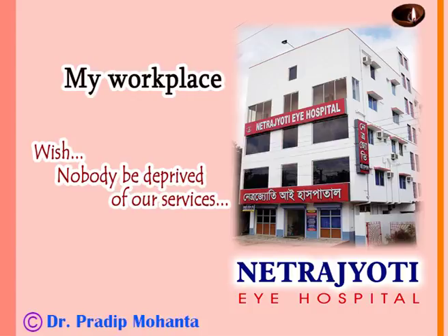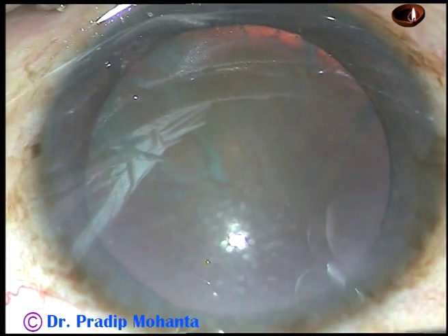Friends, welcome to my hospital at Rana Ghat, India. In this video, I want to show my lens tilt technique.